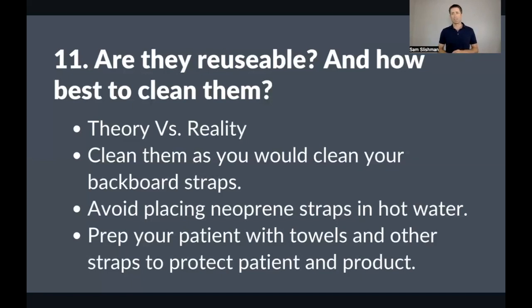I was talking with Terry Smith with Sign Fracture Care yesterday, and I would love to see people use these, and when they feel like they're done, I'd like them to find their way to settings where people can keep using them. It's sad to think of them as single-use disposable, where there's just a lot of trash in the world, and I'd like not to contribute more. So if your service thinks of this as single-use disposable, you might take it and get it to an agency like Sign Fracture Care.